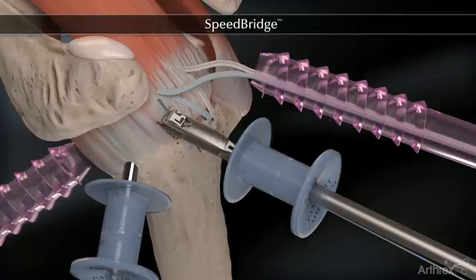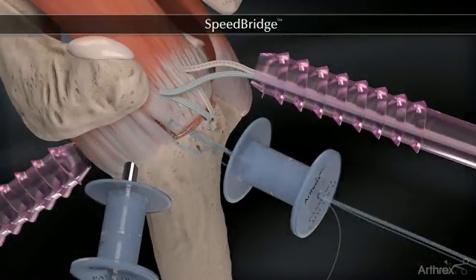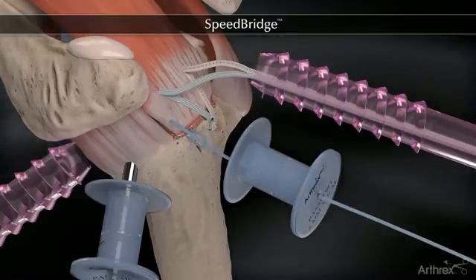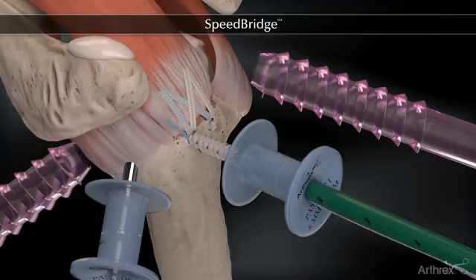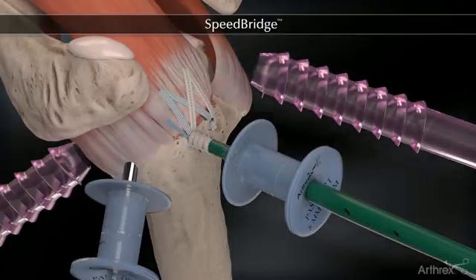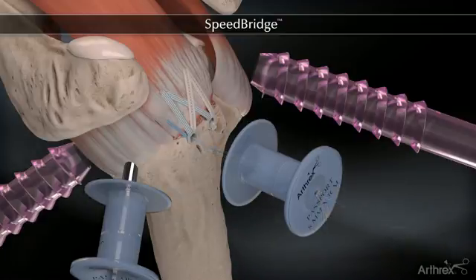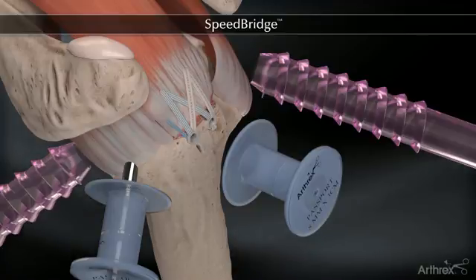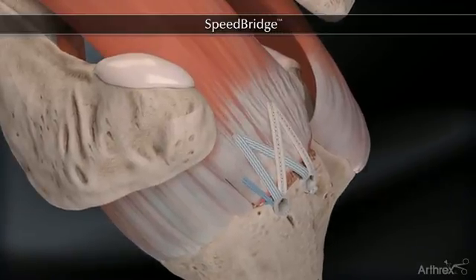If a dog ear is anticipated, it can be reduced using a fiber link suture passed in a cinch stitch configuration. The fiber link and two remaining fiber tape tails are loaded into a second lateral swivel lock anchor, tensioned exactly as described for the first lateral anchor and secured by the anchor body. This completes the totally knotless SpeedBridge repair, which enhances footprint compression to maximize tendon to bone contact.